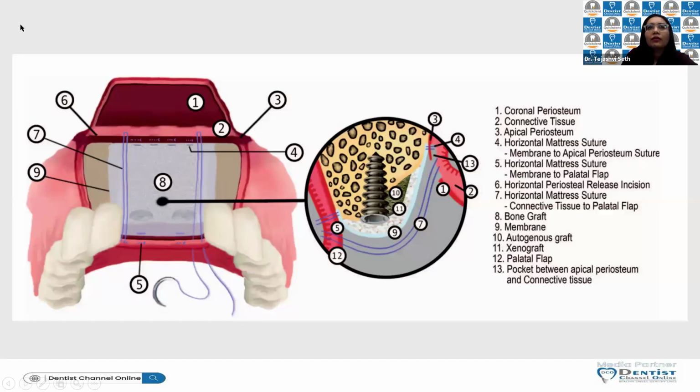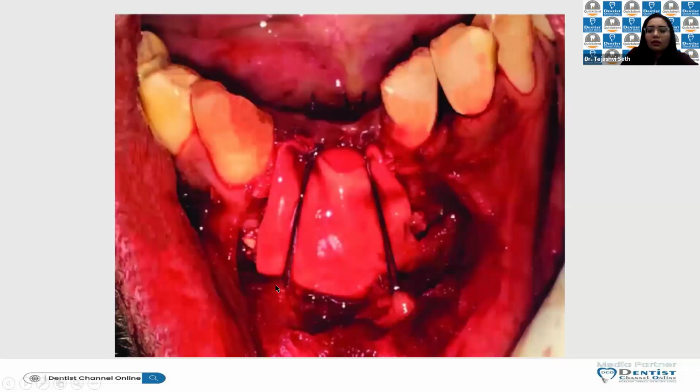Nowadays, a lot of times we don't use non-resorbable membrane. Mostly what we move forward with is the collagen membrane. It is bioadhesive. So even if it is not incorporating the membrane, it has to be stable. Move your sutures. You don't need to pierce your suture through the membrane. You just have to create a barrier so your membrane stays stable.